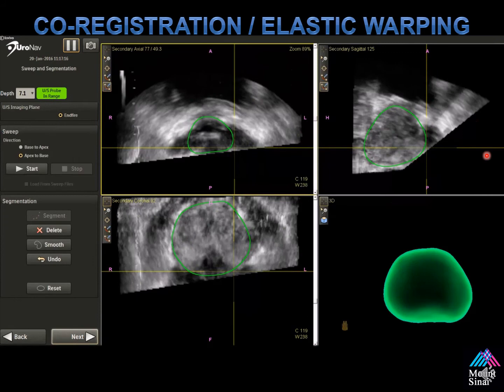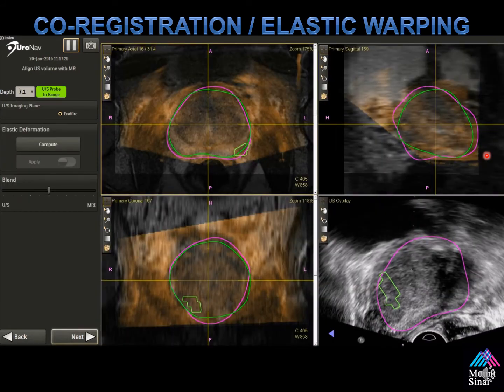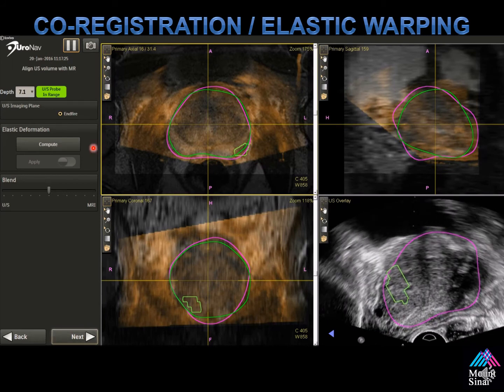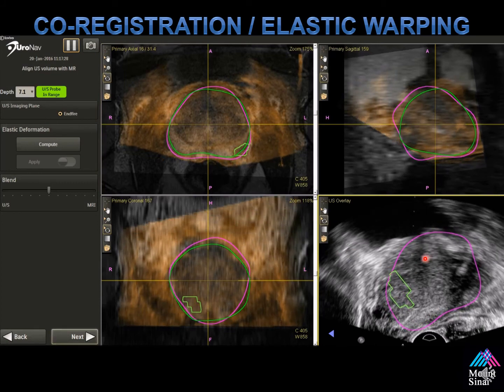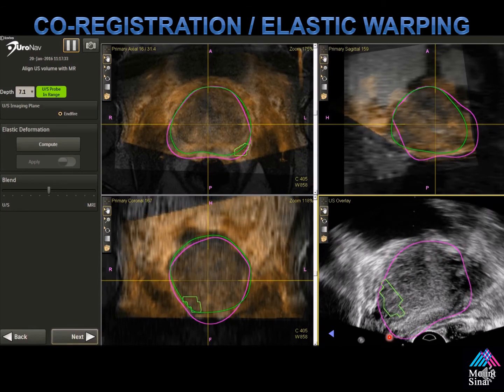This takes approximately 40 seconds or so, though the next version takes only about two to three seconds. It's still important to always check your depth during the procedure and make sure that you line up the anterior border with the MRI segmentation.